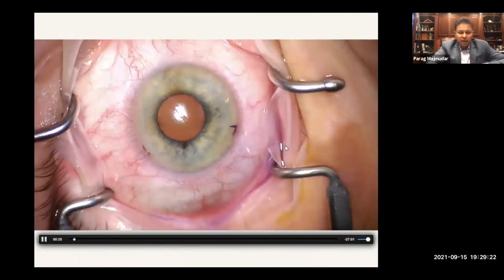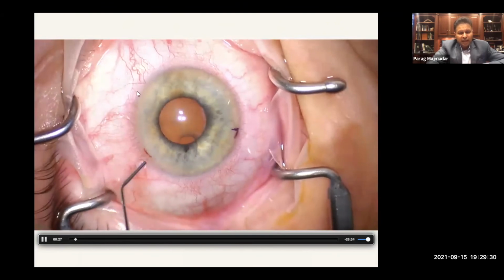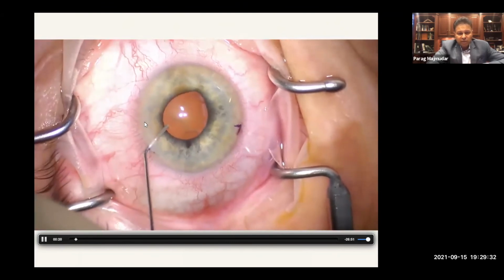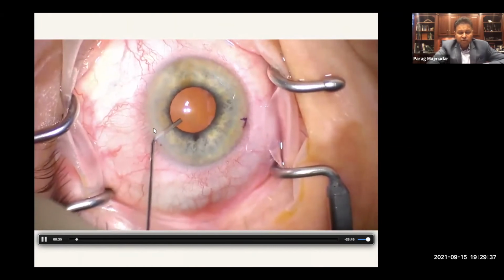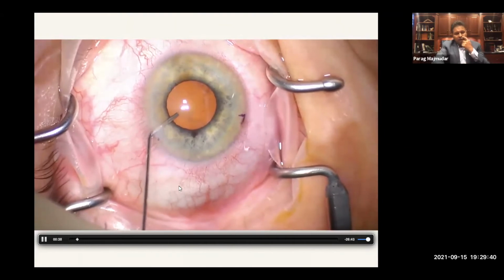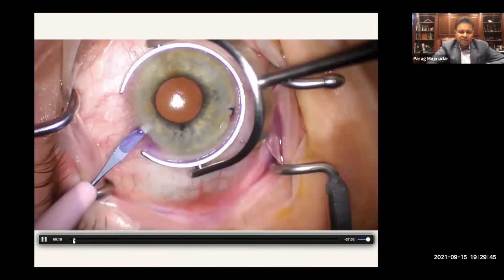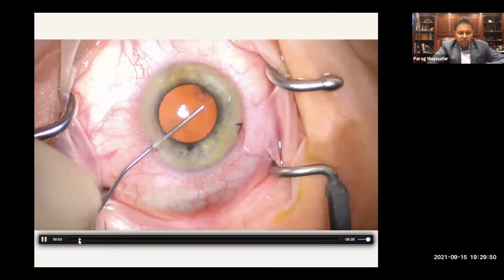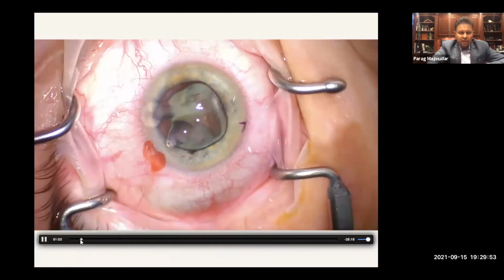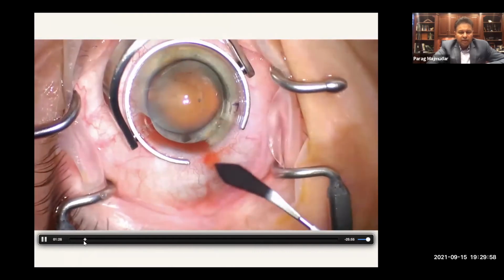You can see here, however, that this is the inferior portion of the iris. This is superior, and I'm operating on the left eye. And I didn't make my paracentesis right here inferiorly at 6 o'clock because I'm making my inferior PI there. I'm using a combination here of the epinephrine lidocaine, and you can see here that the pupil before we start isn't super dilated, but it'll get more dilated as I'm using the epi-lidocaine mixture, and then I'll add a little more viscoelastic in and get it to be fairly big for my cataract procedure.